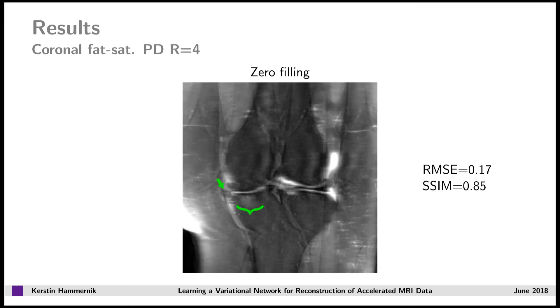Next, I show you results for coronal proton density scans with fat saturation, which have a much lower baseline SNR. This image here shows the zero-filled solution of a 57-year-old female, where the green bracket indicates broad-based full thickness cartilage loss and a subchondral cystic change, and the green arrow depicts an extruded and torn medial meniscus.